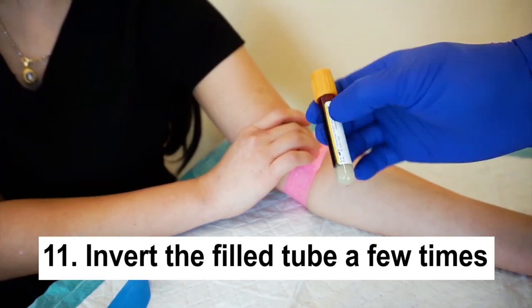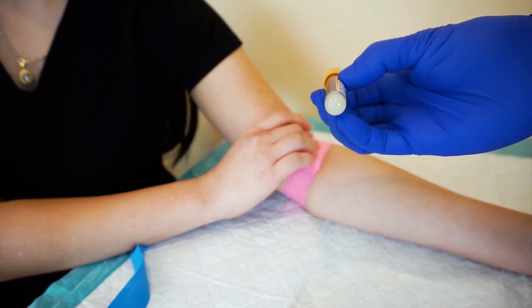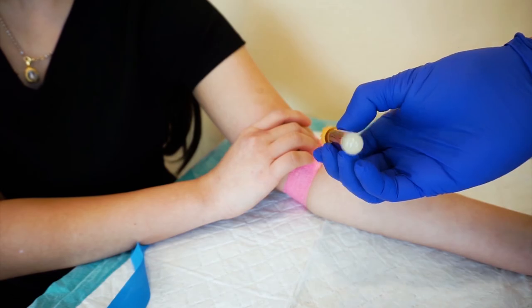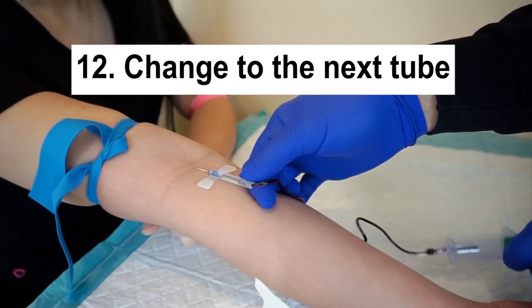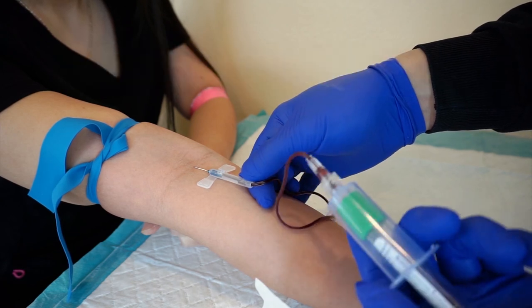Eleven, remove, then gently invert the filled tube a few times to prevent blood clots, and I said gently because you do not want to cause the blood to hemolyze. Twelve, grab the next tube and repeat the process until you have collected all the blood that you need.